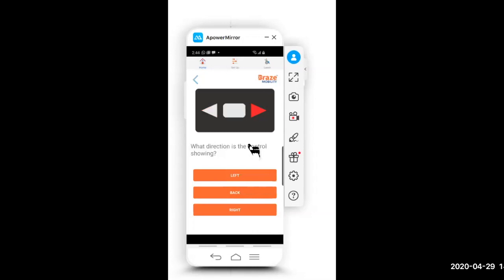So it's not a yes or no here that's saying, oh, if the person doesn't recognize these things or you don't understand what that means, that it's not going to work. It also provides a way to give the person more time, perhaps to learn on their own at home. So they don't have to be in a clinic learning this. It's an app that they can put on their phone or any family member's phone or their own phone and can with time learn what these things mean. And then when they're ready, perhaps try the system.